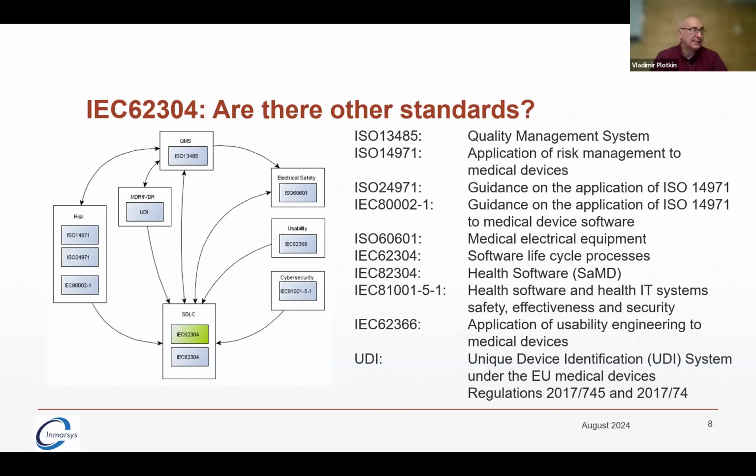You have the usability standard, which is 62366, which is talking about how the user is going to be interacting with the device, what kind of limitations and what kind of functionality you need to implement for the medical device. But this is where the foreseeable use and misuse is coming from as well.